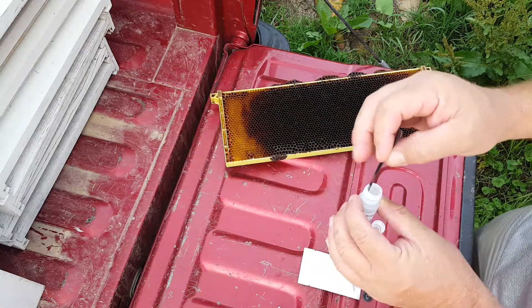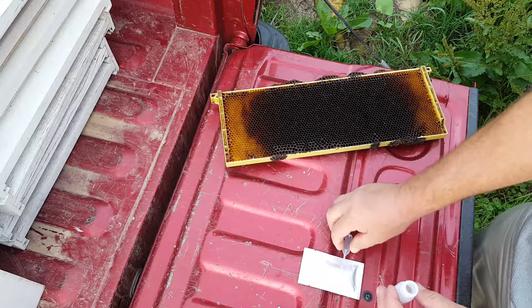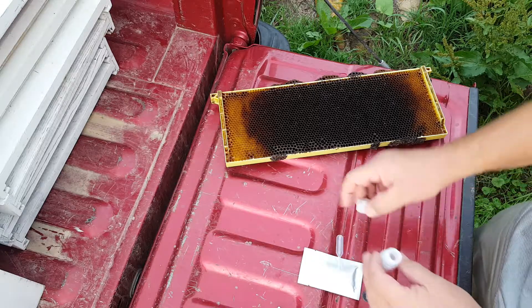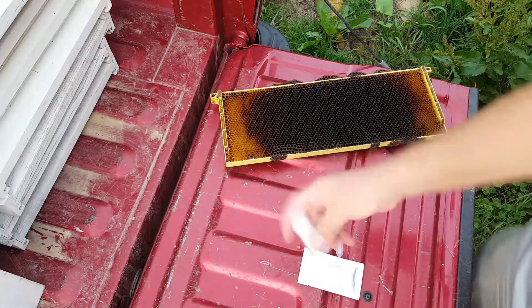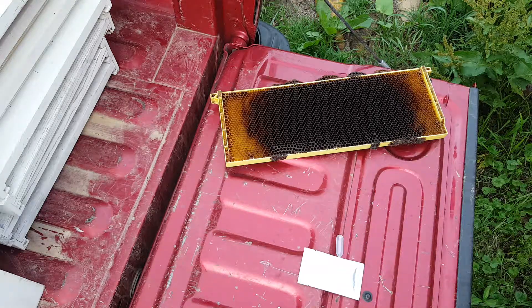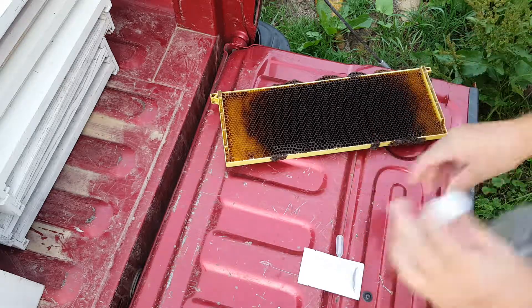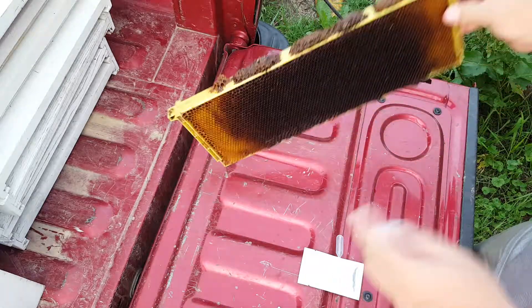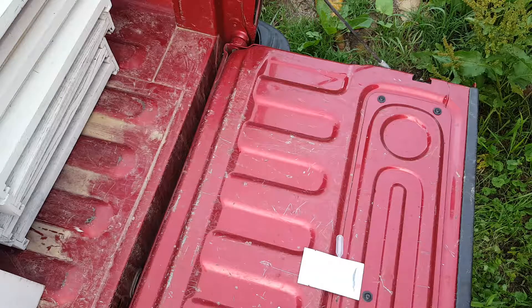Make sure it comes off and there's nothing left on there. Go ahead and put that in the bag, then don't jump the gun — put your cap back on and start shaking it up. Keep shaking for a while. In the meantime you can go ahead and put the frame back in the hive. Keep shaking.